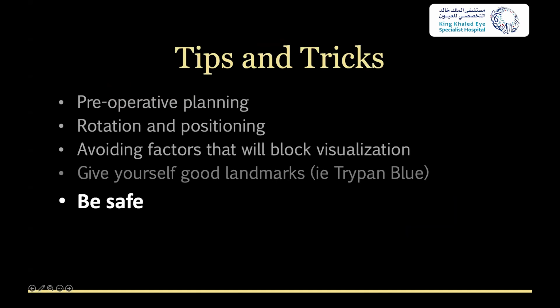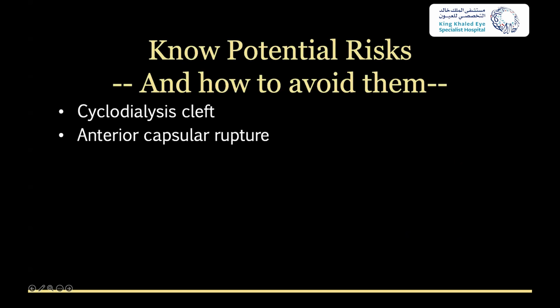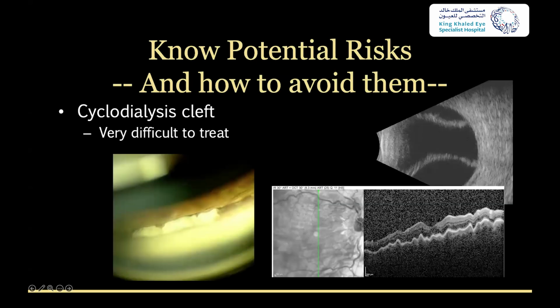And then the last thing I always say is to be safe. There are potential risks with minimally invasive surgeries. It is called minimally invasive, but we do see risks with it. One of the scariest ones I would say is a cyclodialysis cleft, because these can be very, very hard to close. And then anterior capsular rupture as well. A cyclodialysis cleft can cause a lot of visual morbidity and can be really challenging to treat. Often they end up with a vision worse off than you started. So we try to do everything we can to avoid that.